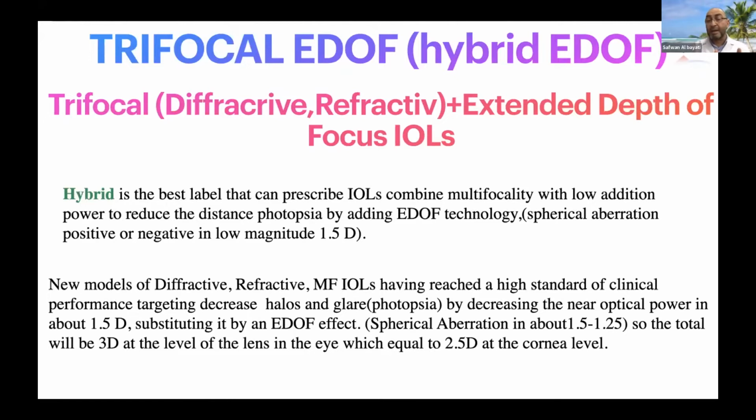In this way, we will reduce, not eliminate, the photopsia, and we will have near vision better than pure EDOF. This is the aim.